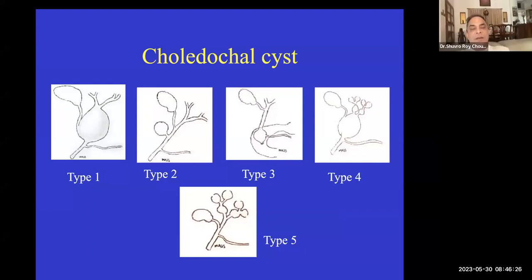So again, I miss the CT cholangiography study. It used to be so elegant, so beautiful. It can demonstrate the leak very clearly. Now people are saying that 3D ultrasound can show the dynamic leak. They are saying that you can, in fact, demonstrate that the bile is leaking out of the bile duct. I was never a fan of this 3D ultrasound.